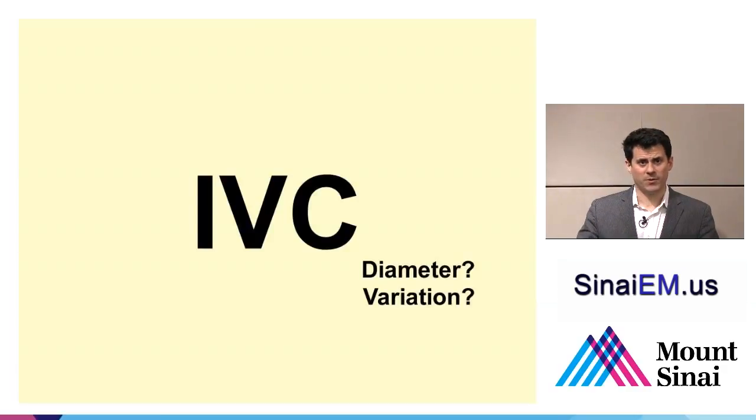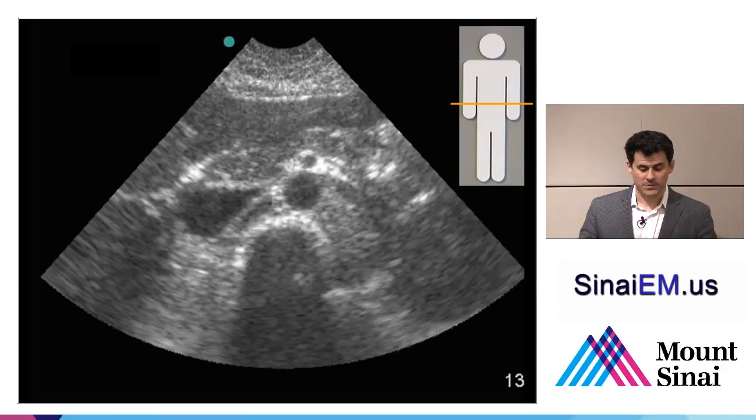So by focusing on a very practical question, increased cardiac output with the administration of a fluid bolus, we can probably get some more accurate answers than if we were just holding the IVC up to try to mimic results of the central venous pressure, which is falling a bit out of favor in critical care circles anyway. So here's how we look at it.